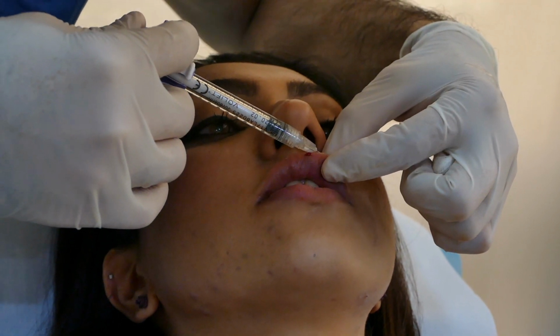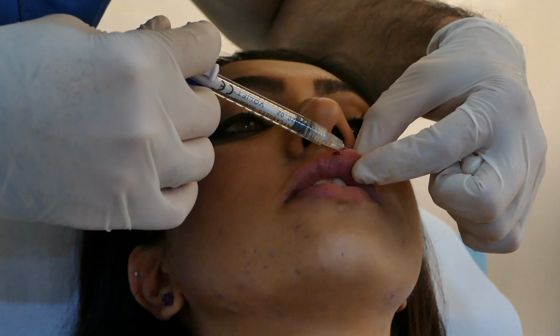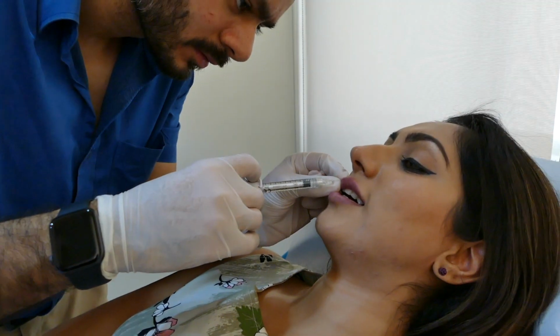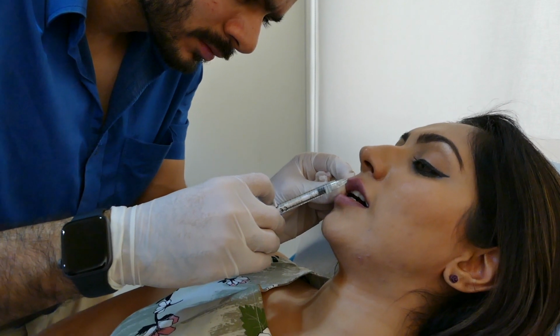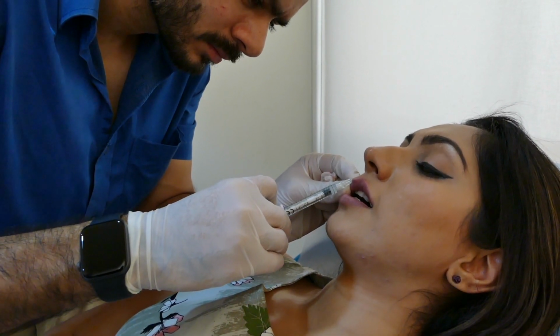You can see a tiny quantity is being injected and a small quantity is injected into the philtral column. And that's the before and after. You can see the significant asymmetry of the lips that has been significantly corrected using 1 ml of filler.